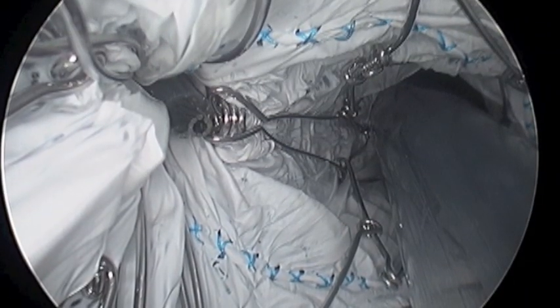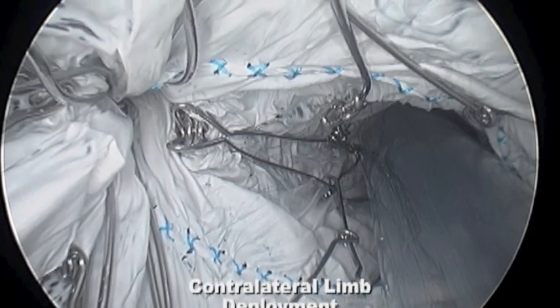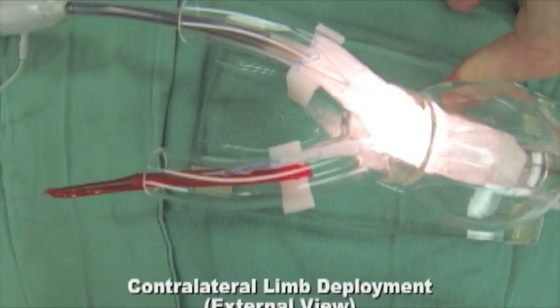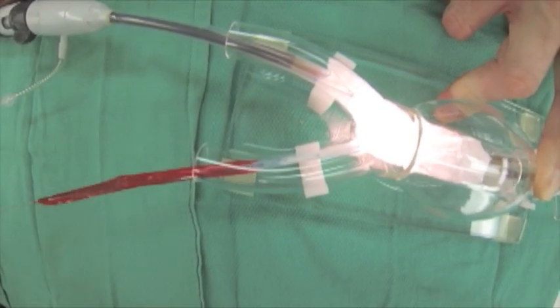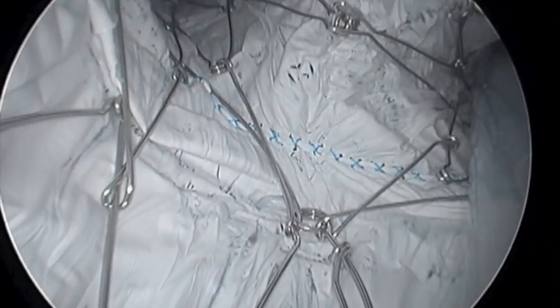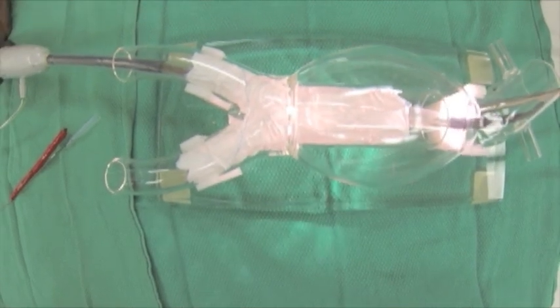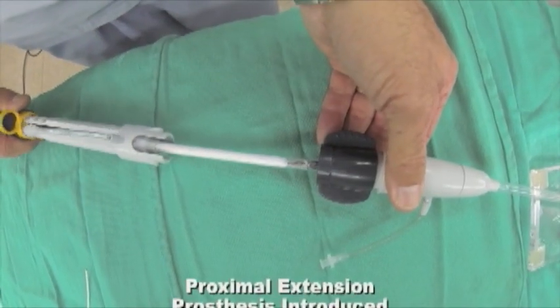Here you see the sheath being inserted. Now looking at the contralateral limb — that was the 035 hypotube, through which a 014 wire can be inserted in order to maintain access on the contralateral side. Then the contralateral limb is deployed, as seen in that video. Here's the unibody bifurcated stent graft in position.